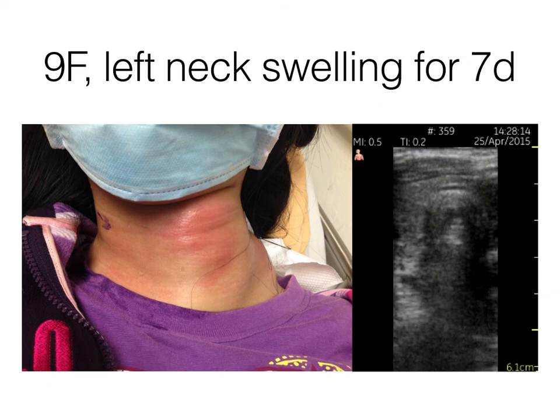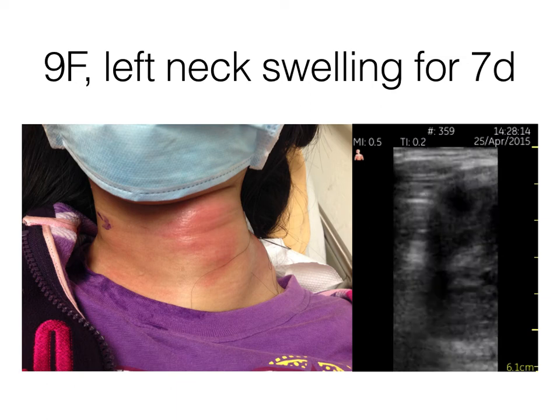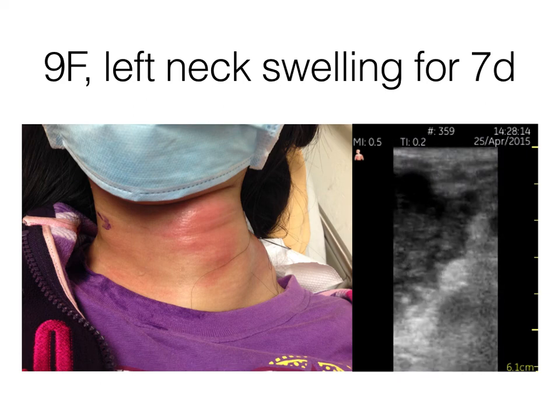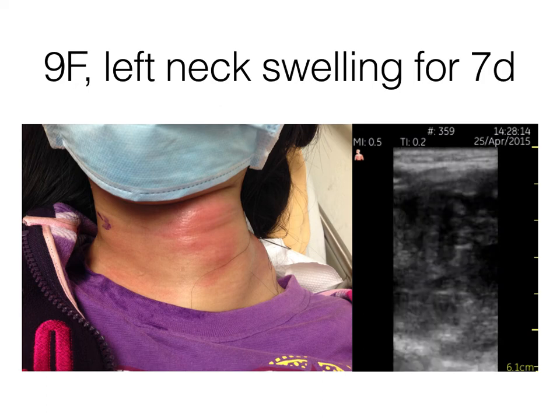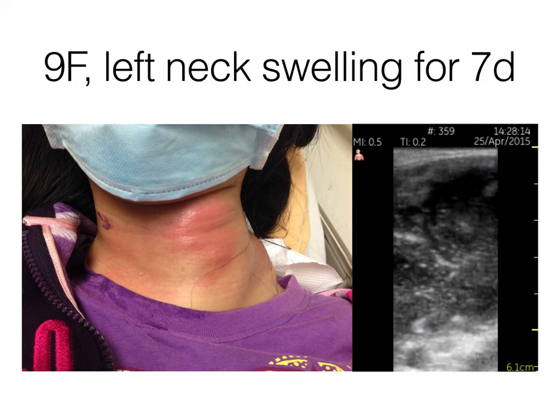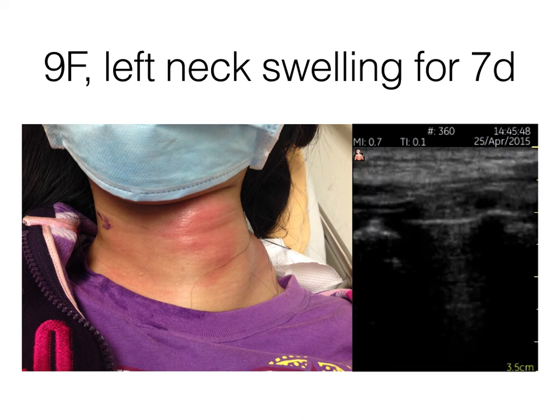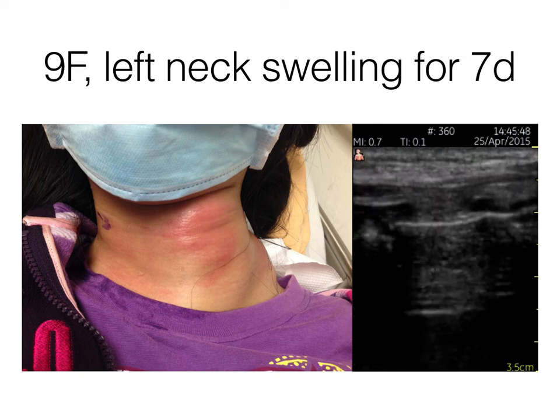And then we scan from here to the right transversely. The structure you are familiar with, right? What is this? Trachea. Trachea to the right side. Okay, I can see the whole picture, where the trachea is and how far away from the midline it is. Then the last question, I have to prepare. Although this patient breathes normally, I have to prepare. So that's why I do this scanning.